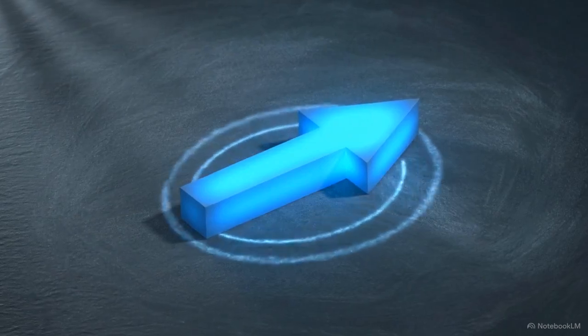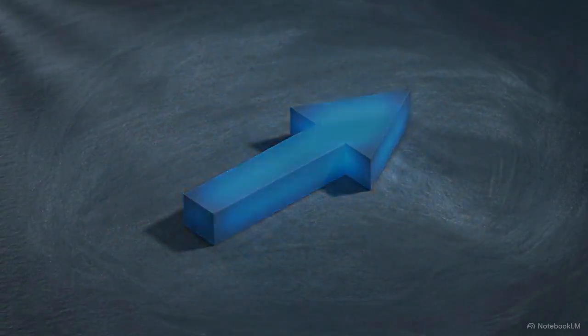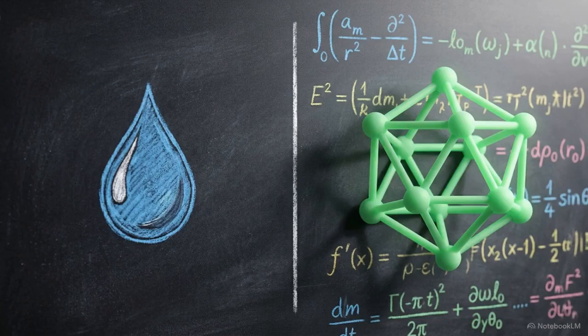But this high-energy state is unstable. The signal immediately begins to decay as the entire system tries returning to resting equilibrium. That return to equilibrium doesn't happen through one single decay process. It is driven by two completely distinct physical mechanisms happening simultaneously.